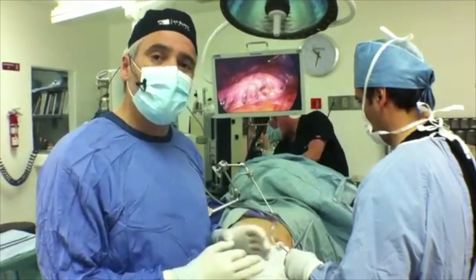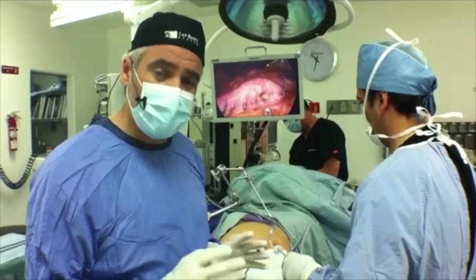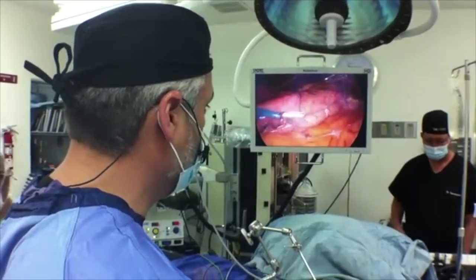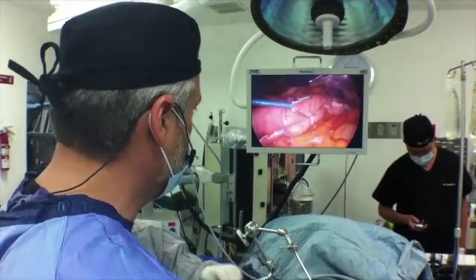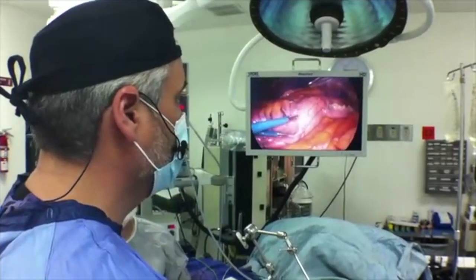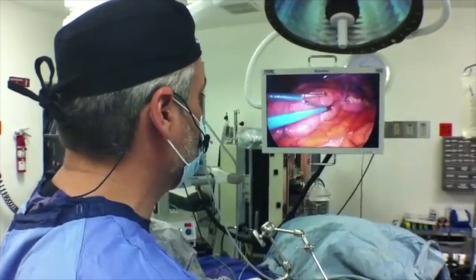This combination is what creates a safe gastric plication, free from gastric perforations. We're going to start the surgery and I'll explain as we go. Within about half a minute, we have one, two, three stitches. These three stitches are forming the first layer, creating this tubular-like stomach.